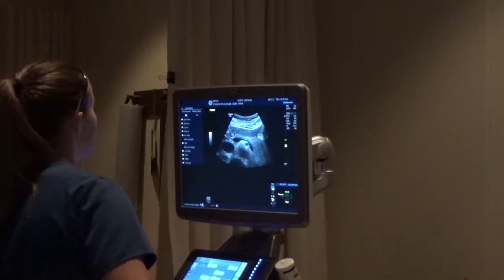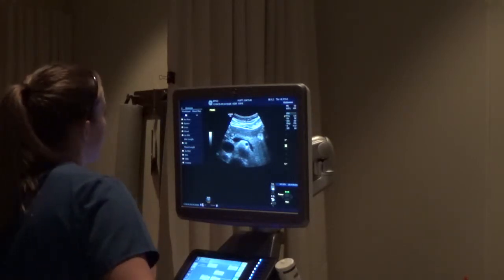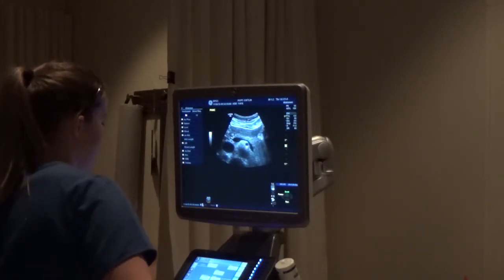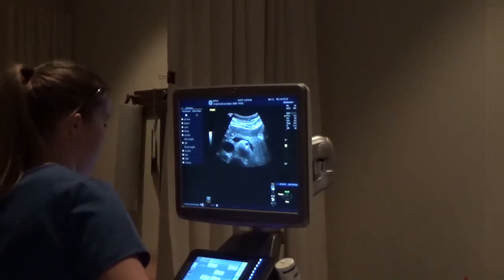It could, because it can obstruct the CBD. Okay. And what else can the pancreatic mass obstruct? The pancreatic duct as well. All right. And what's the upper limit of normal for the pancreatic duct? 2 or less. Okay. What structure courses along the posterior of the body and tail of the pancreas? The splenic vein. Okay, and then get a waveform of the splenic vein and then store that in place.